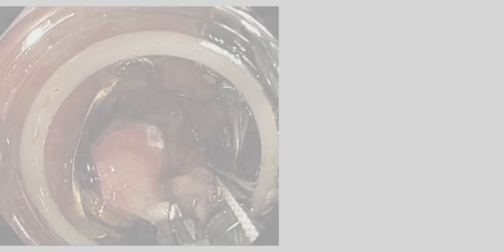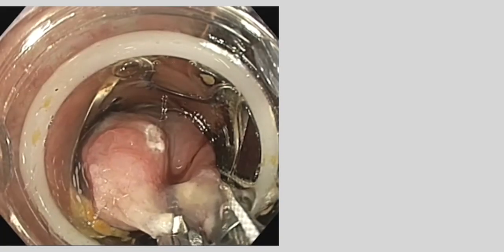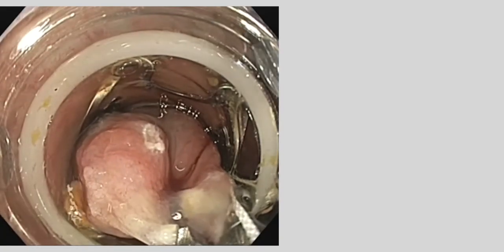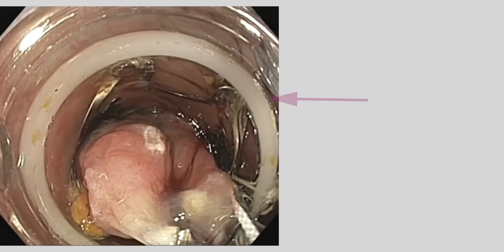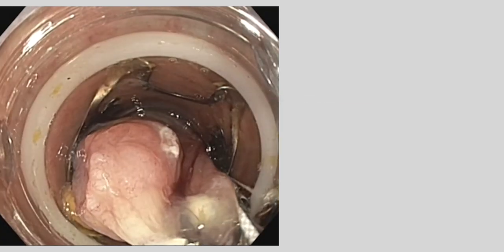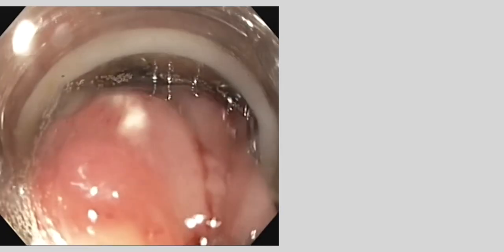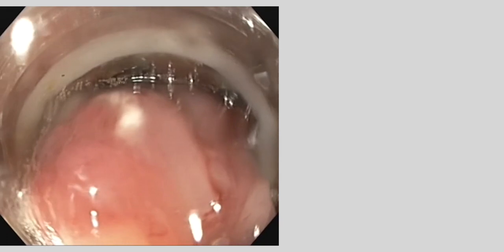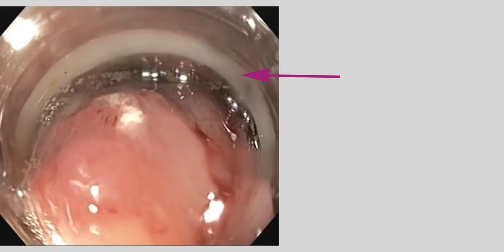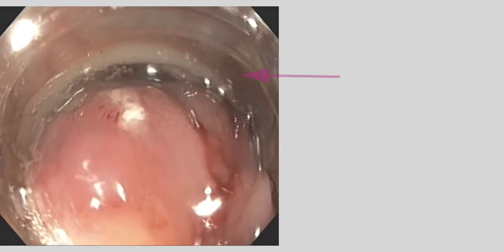Make sure that the clip has been properly applied before resection begins. If the clip has been successfully applied, the white ring will have moved forwards to the edge of the cap. It must remain visible and be observed in the endoscopic image. Only when the white ring has moved fully forwards to the edge of the cap, you can be sure that the clip has been applied.